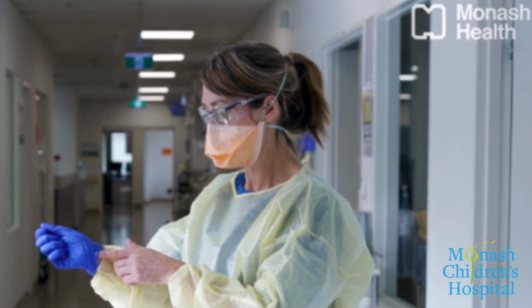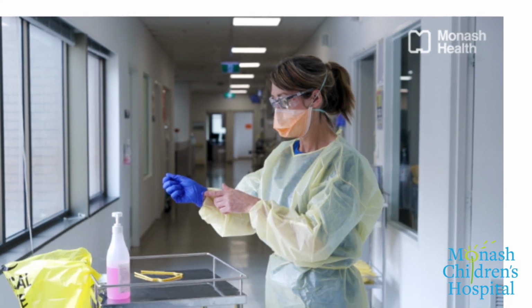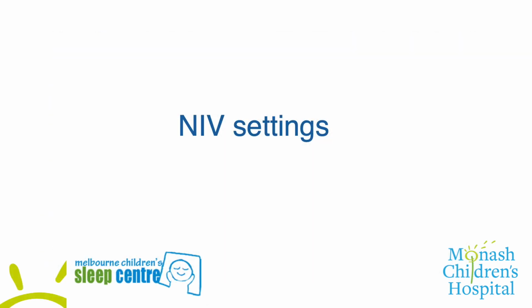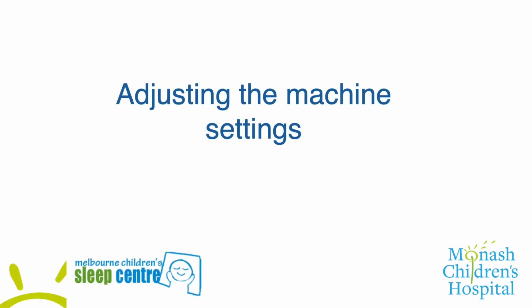NIV and CPAP increase aerosolization of infectious agents from the airway, and so use of personal protective equipment should follow institutional recommendations. Treatment settings will be prescribed by medical staff, including the pressures, the inspiratory positive airway pressure known as IPAP, and the expiratory pressure or EPAP, known as PEEP in ICU settings, and the breaths delivered per minute. Settings will be adjusted as needed according to the patient's clinical situation.